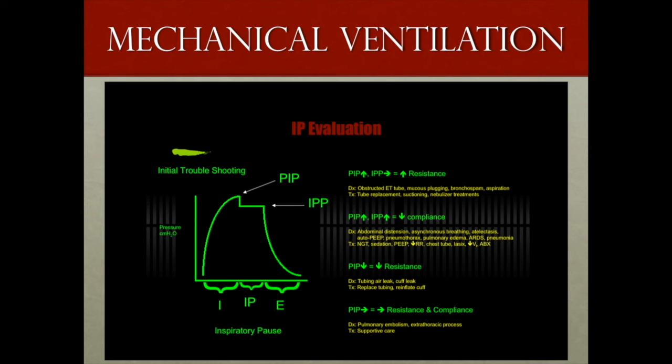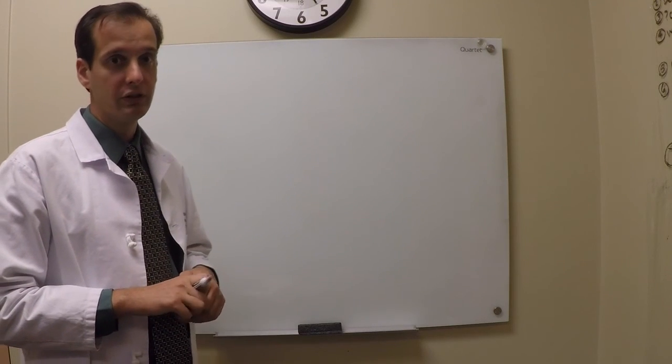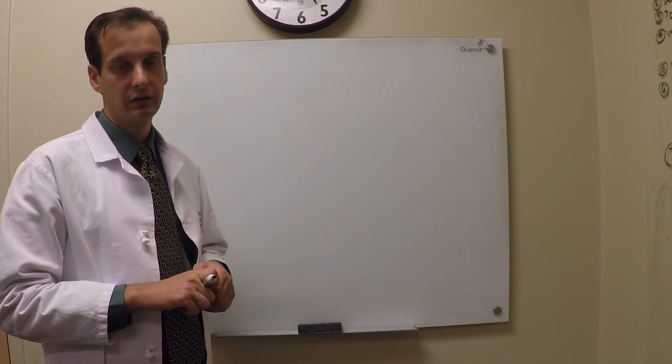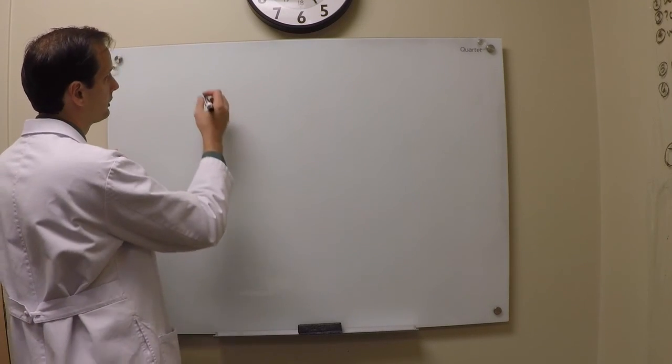The source of hypoxia can be attributed to either resistance or compliance problems or both, and a differential diagnosis can be built accordingly. When you're performing an inspiratory pause as a method to assess pressures and to aid with your diagnosis of a particular hypoxic problem, you can end up with several scenarios. So remember the components of your breath.